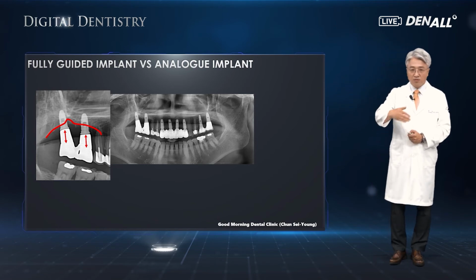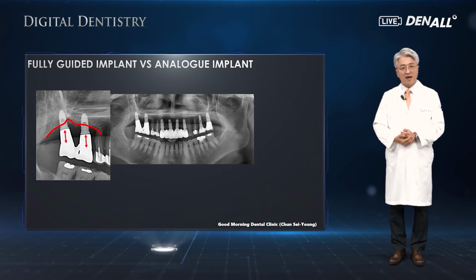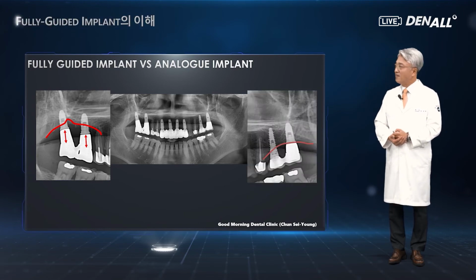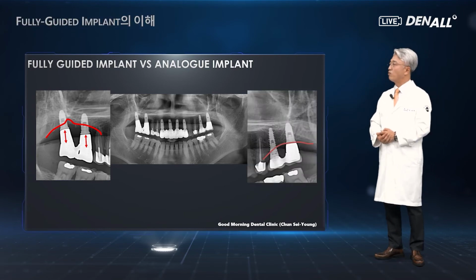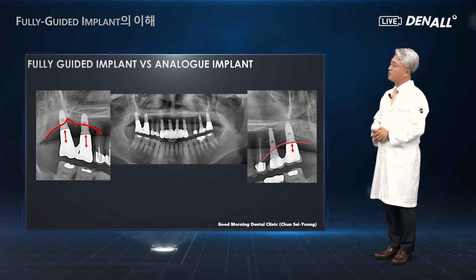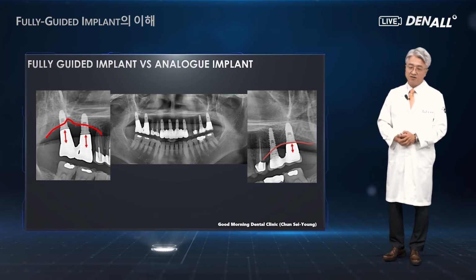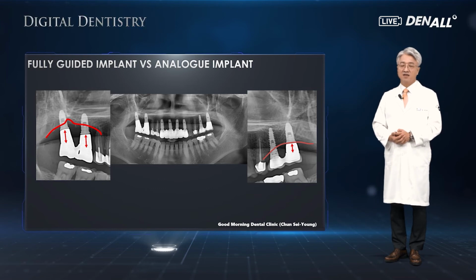In these cases, it is not very good for self-cleaning and tooth cleaning. Therefore, the bone is resorbed quite severely. On the opposing side, the implants were placed in the same dental office. Number 7, the abutment is very long. Therefore, this is a case where peri-implantitis was bound to happen. That's what I thought.